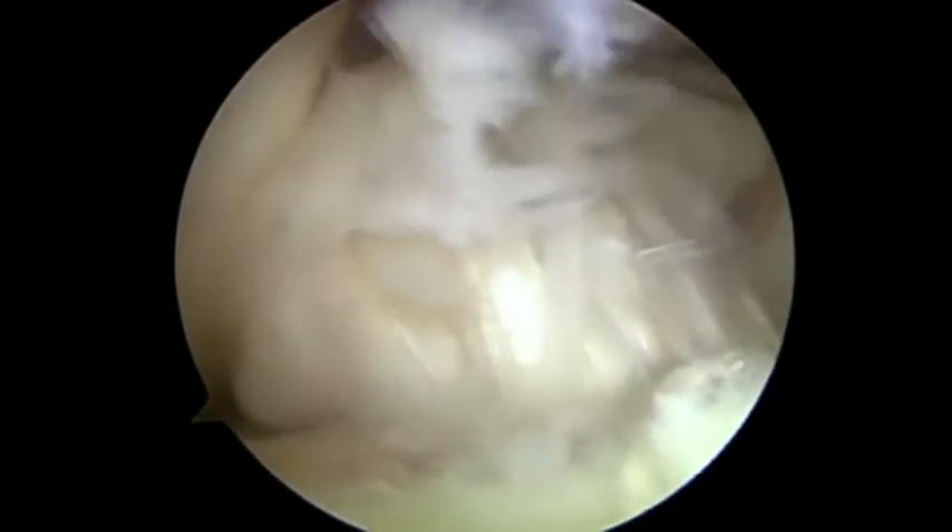This is a probe into the lateral compartment demonstrating engorgement of the anterior cruciate ligament with mucoid degenerate change within the fibres, causing the ligament to fill out of the femoral notch and spill into the lateral compartment.